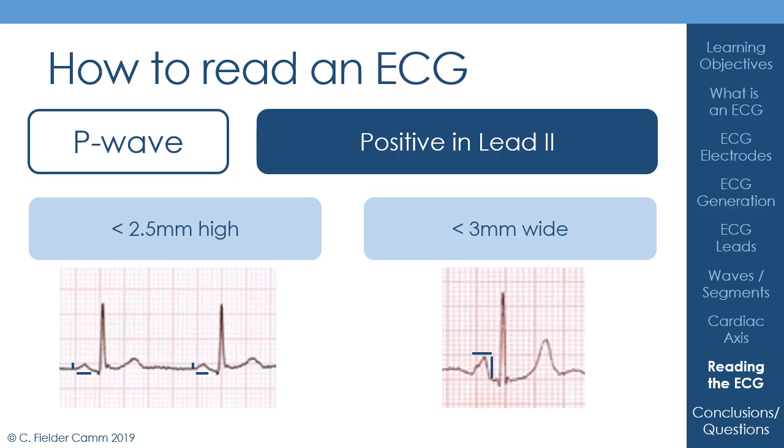And it's called mitrale for a couple of reasons. One, it represents problems with the left atria, so mitrale for the mitral valve, but also the P wave looks like an M, which is helpful to remember. You may hear P pulmonale being described for P waves that are too high, and that's because it represents a right-sided problem, so a pulmonary valve problem often.